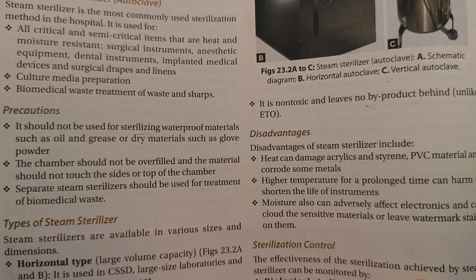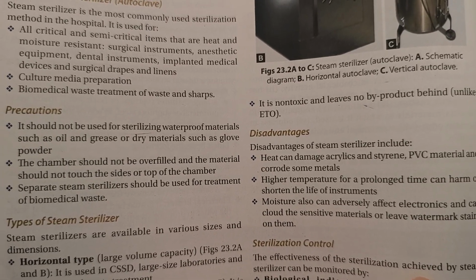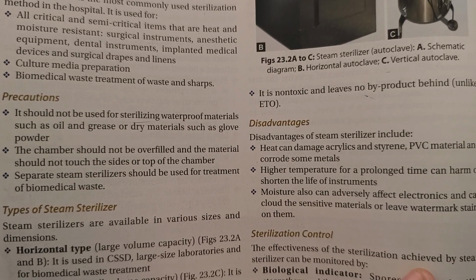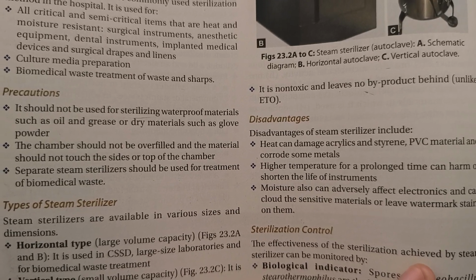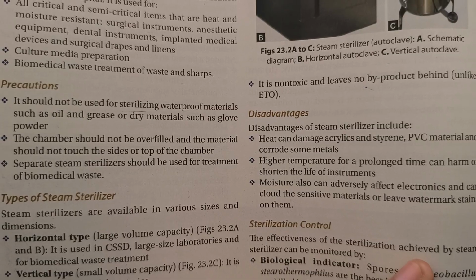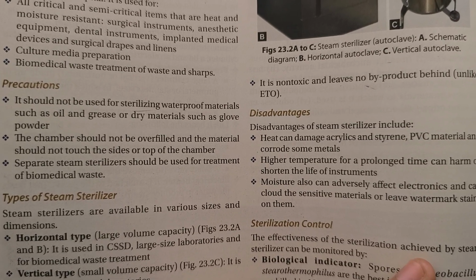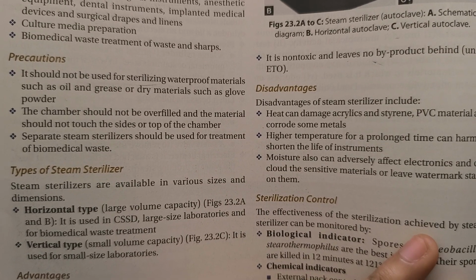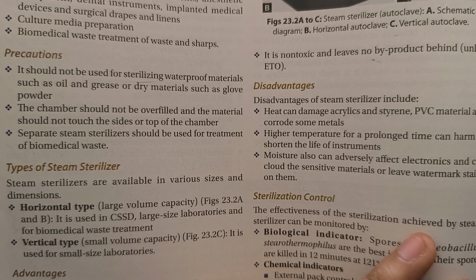Uses of steam sterilizer, autoclave. Steam sterilizer is the most commonly used sterilization method in the hospital. It is used for all critical and semi-critical items that are heat and moisture resistant: surgical instruments, anesthetic equipment, dental instruments, implants, medical devices, surgical drapes, and linens. Also culture media preparation, and medical waste treatment.